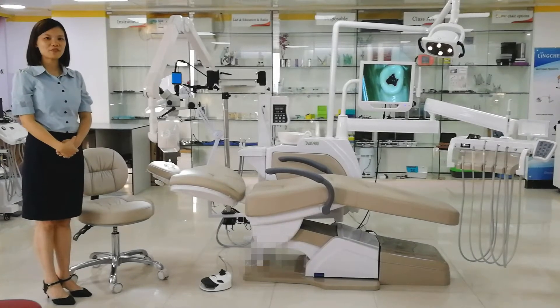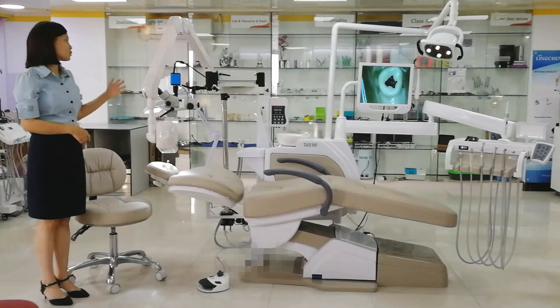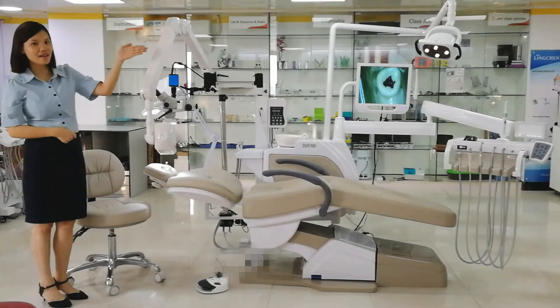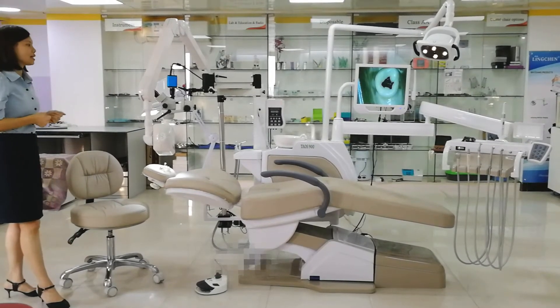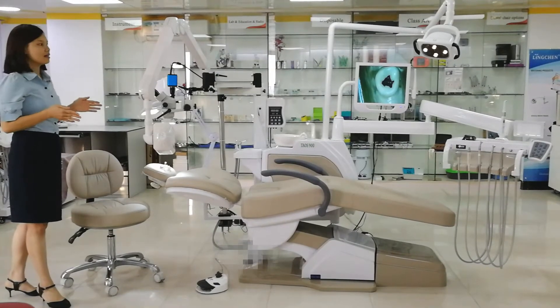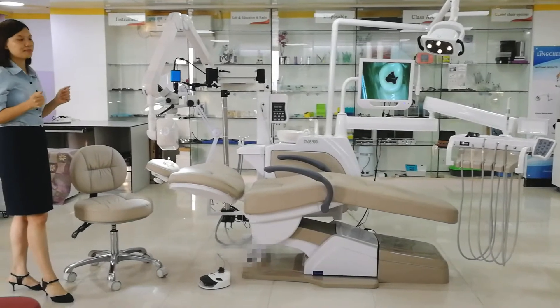Hello, this is Sophie from Lin Chen Company. Today we will see one dental chair. It is with microscope, x-ray, goggles, and camera in line. We call this one the Essential Clinic Unit. This chair is designed for both dentists and patients, to let them feel less stress. Now we will see the details one by one.